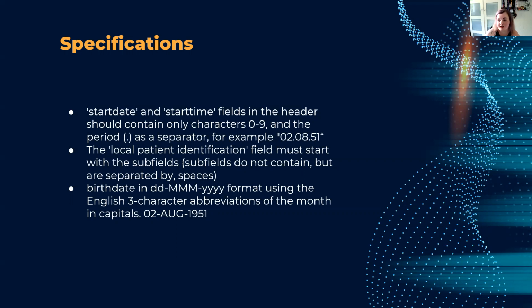Now, it also includes the birth date of the patient in a day, month, year format. This machine was a South African machine. So quite possibly this could change depending on your region the machine was bought from. I'm thinking specifically in the US. So these are very important because this is how we correlate evidence and timelines, using these specific values.